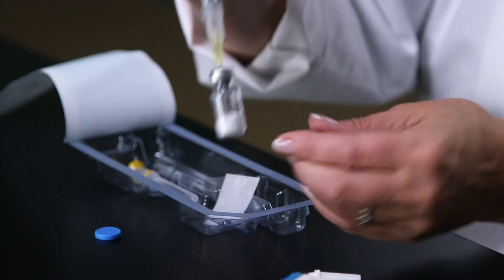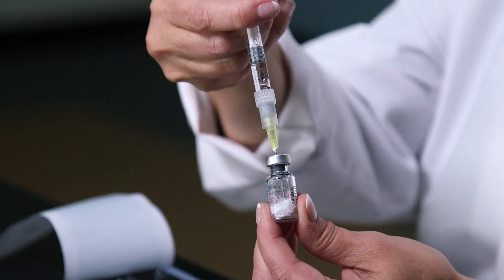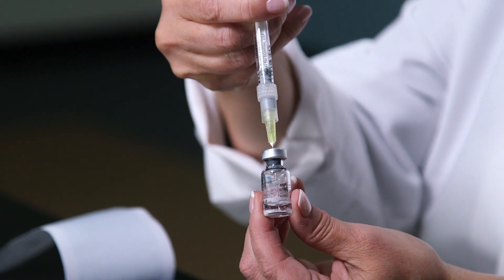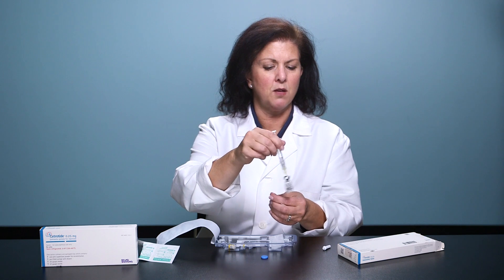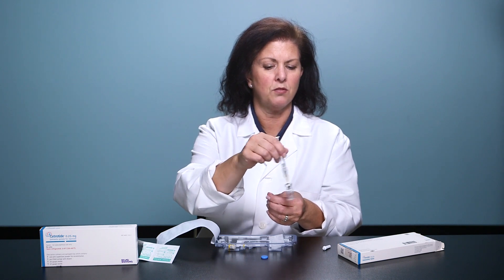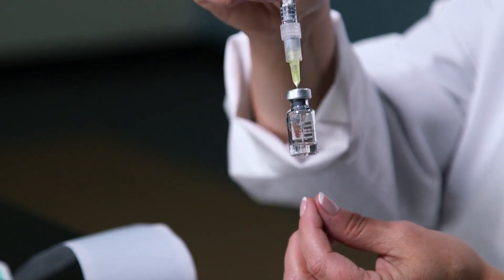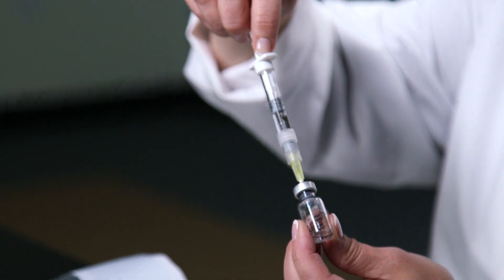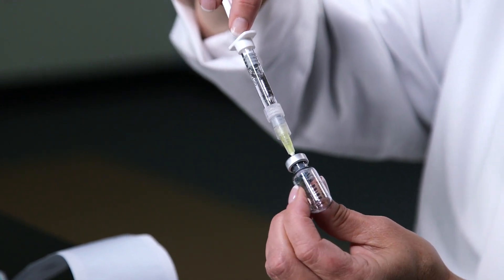Press the needle through the rubber cap and inject the water slowly into the Cetrotide powder. Cetrotide may take up to a minute to dissolve. Do not shake it, just gently swirl it. When it is completely dissolved, pull back on the plunger to remove all the liquid.